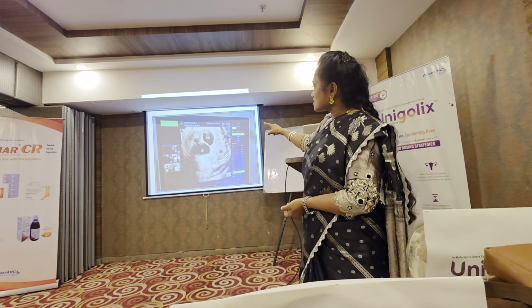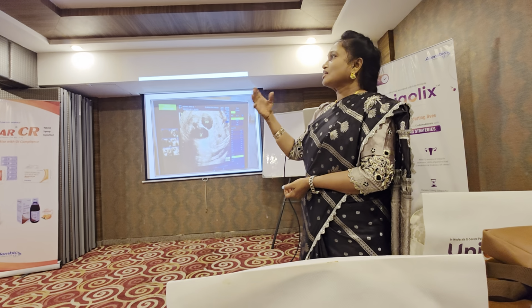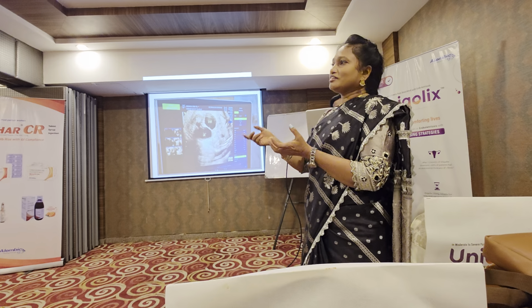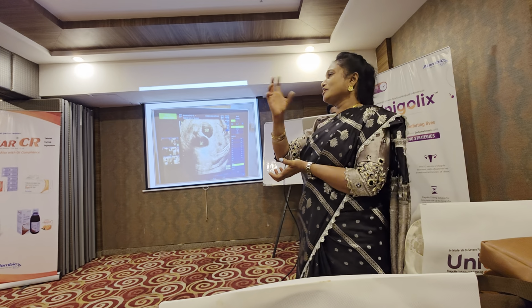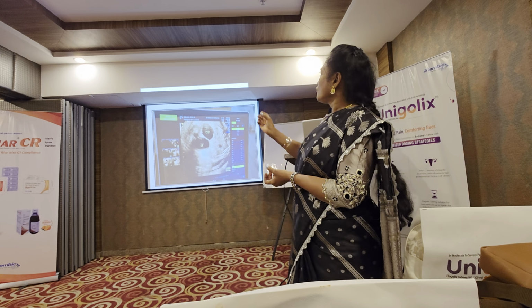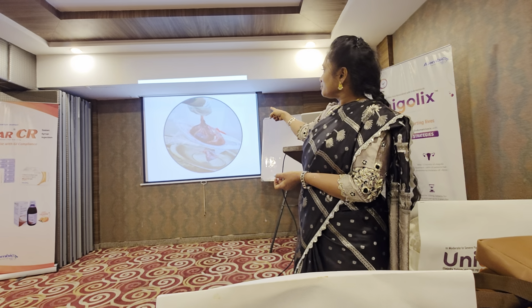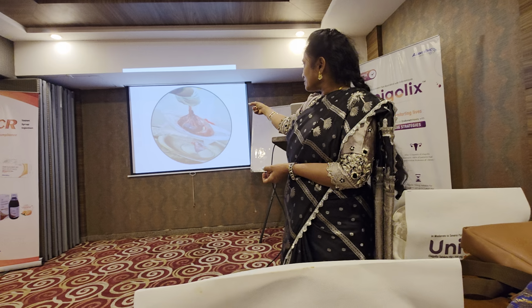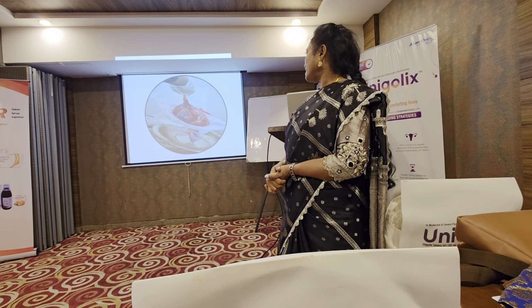There was a cyst just beside the urinary bladder. We looked at it after a week, and it was still there. But when we tried shifting the mother, the cyst was shifting from one side to the other. So we had a doubt whether it is inside the baby's fetal abdomen or attached to the placenta. Next one. When we delivered the baby, we saw that it was just adjacent to the placenta. Nothing wrong with the abdomen of the baby.